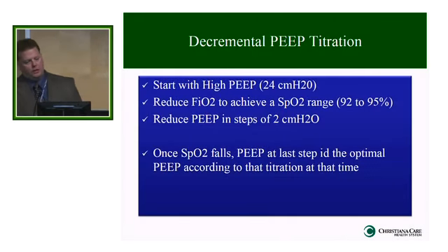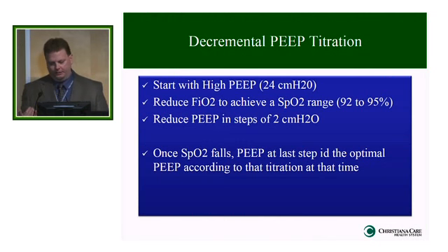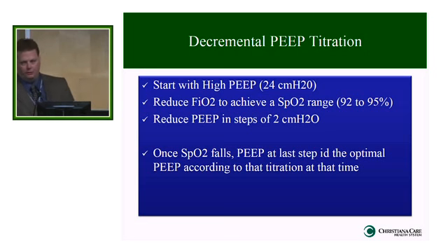Instead of just applying PEEP in those situations, you can do something that is a very rigid thing, something you call decremental PEEP titration. Some do an incremental and a decremental PEEP titration. The focus really has come down to the decremental PEEP piece of it. In other words, you're going to hear me say it's a regimen, a way that you adjust PEEP and you watch things and make sure that the physiologic parameters go in one direction as you titrate PEEP.